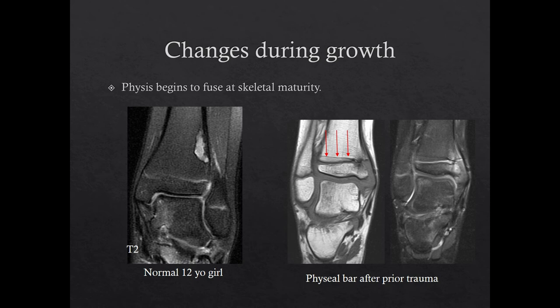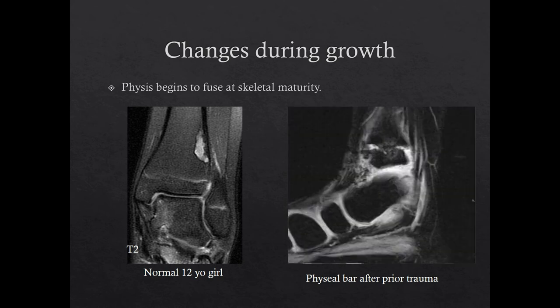Contrast the appearance of physeal fusion with a physeal bar, which can form after prior trauma to the physis. On the right, there is a physeal bar along the medial aspect of the distal tibial physis. This patient had a prior fracture of the ankle. If you look at this growth arrest line, you can see it is asymmetric and does not parallel the physis. Therefore, although this physeal bar is small, it will lead to an angular deformity of the ankle over time. You can see the physeal bar even better on this sagittal gradient echo image in the same patient, where there is an absence of the normal bright physeal signal.